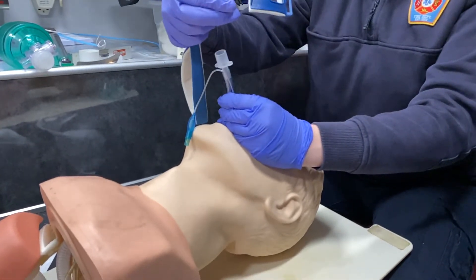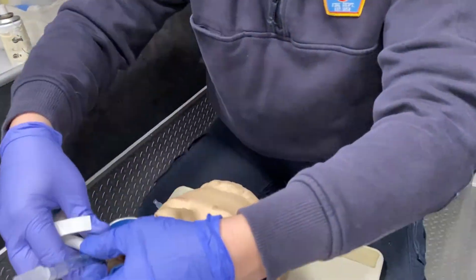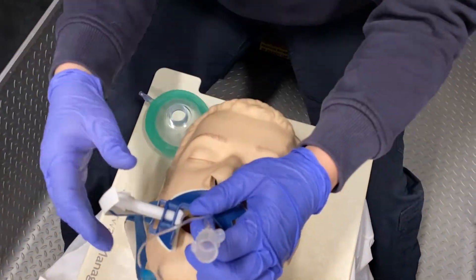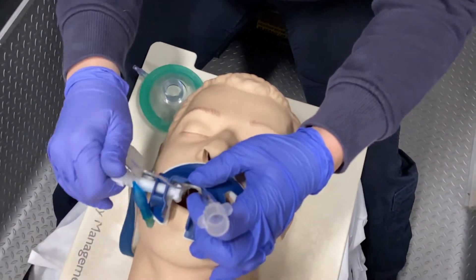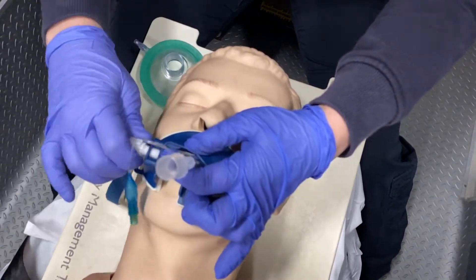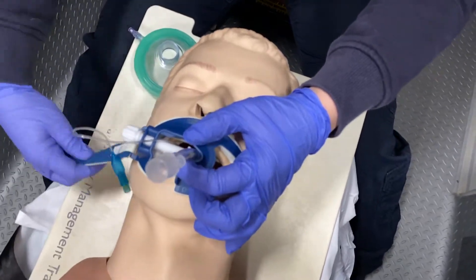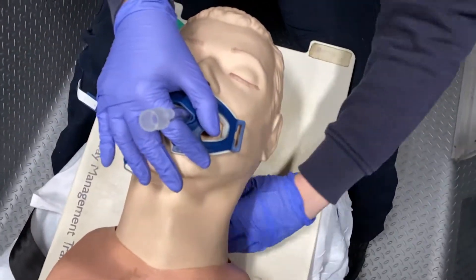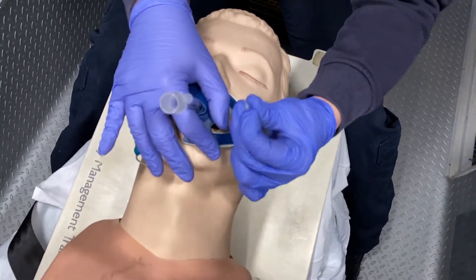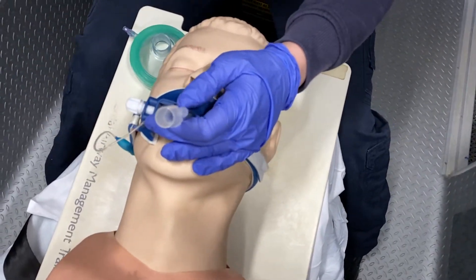We're going to use the same commercial tube holder that we used for our King airway. Make sure the bite block goes between the teeth and your balloon is out of the way. You're going to tighten down the ET tube, then put your strap around the head — never letting go of your tube. And now your tube is secured.